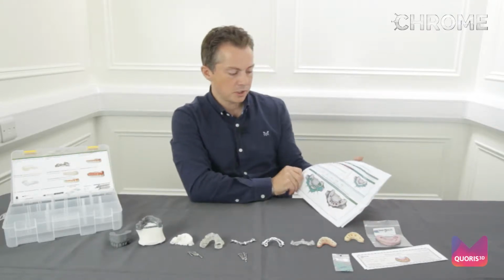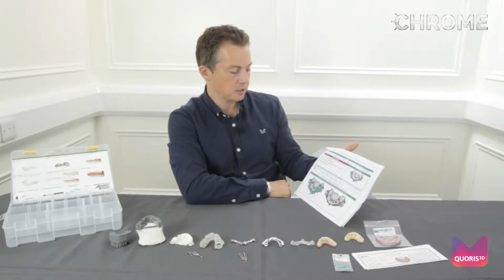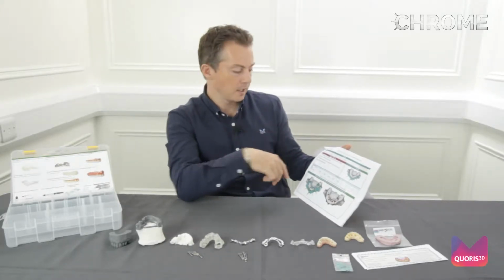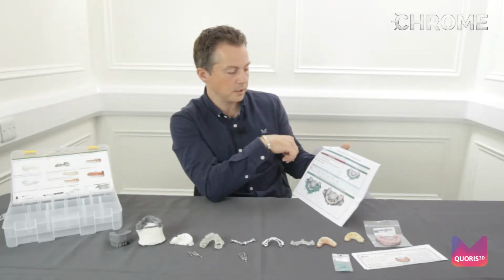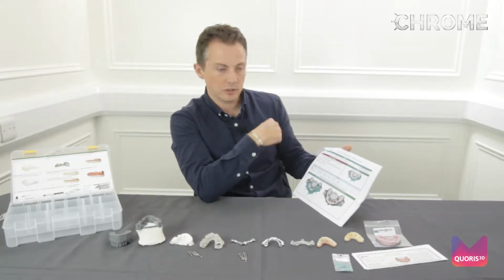On the second page, it gives a little bit more detail. Along the top, it tells you what fixation pins you will need to use to fix the fixation plate in place. In this case, there are 4 pins, both long and short pins. And over here, it tells you the length of the pin and the drill distance.